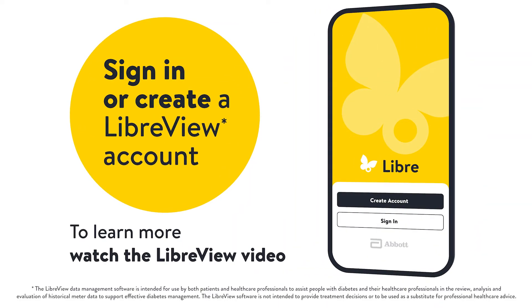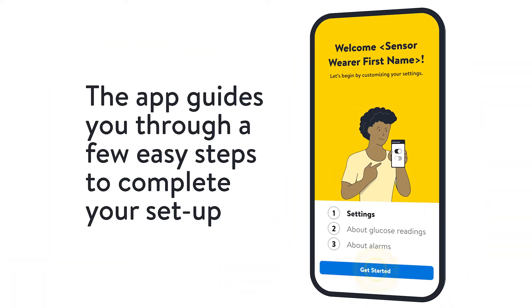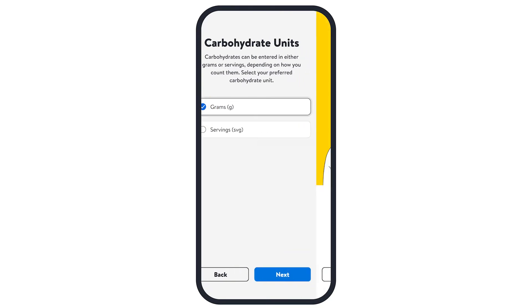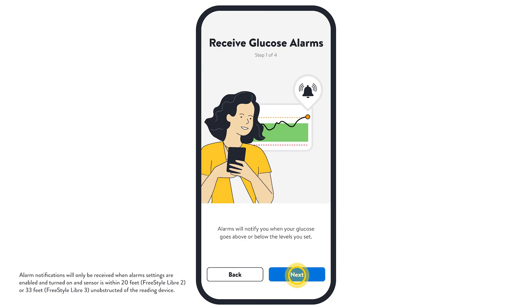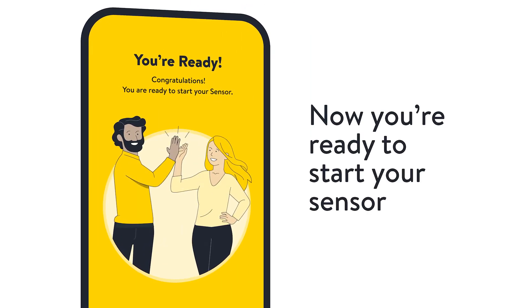Sign in or create a LibreView account to continue. The app will guide you through a few easy steps to complete your setup. Once your setup is complete, you're ready to start your sensor.